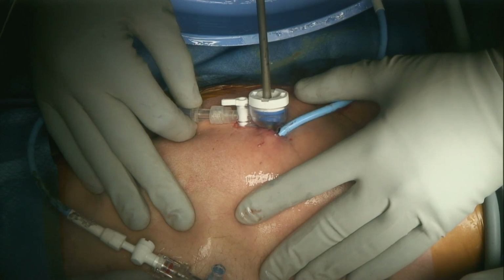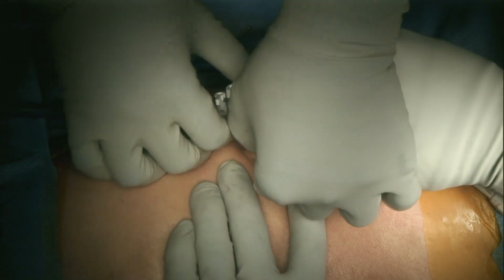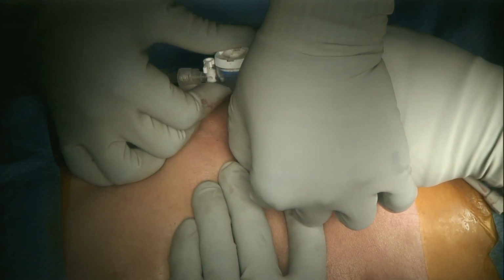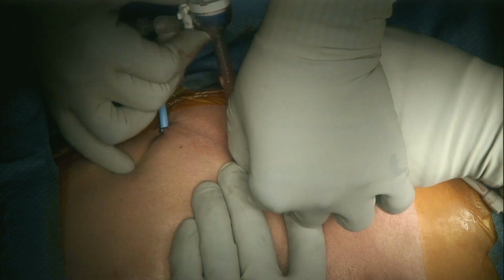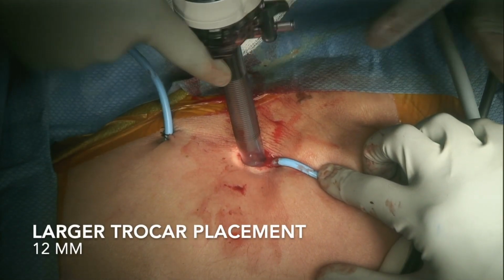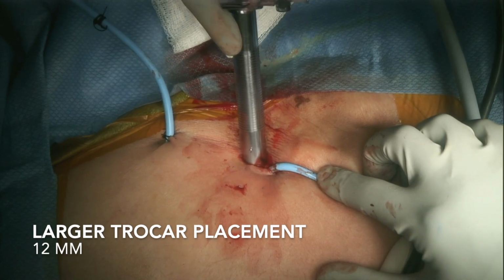In conclusion, video-assisted retroperitoneal drainage can be used to manage complex pancreatic necrosis even in the background of cancer with good outcome. It is vital to plan trocar placement based on preoperative imaging and body habitus to gain the maximum advantage from the VARD procedure.